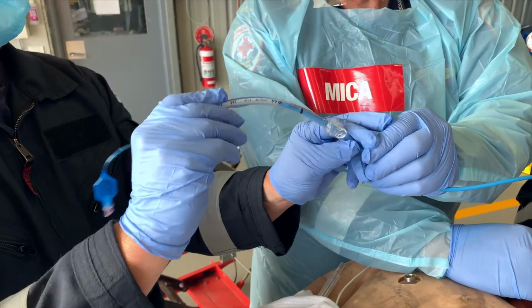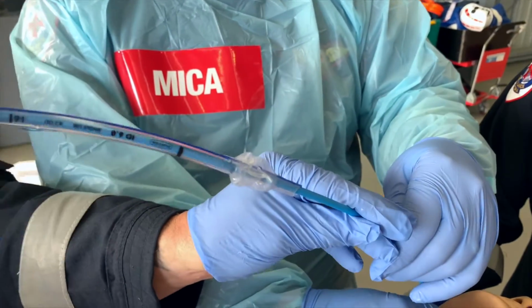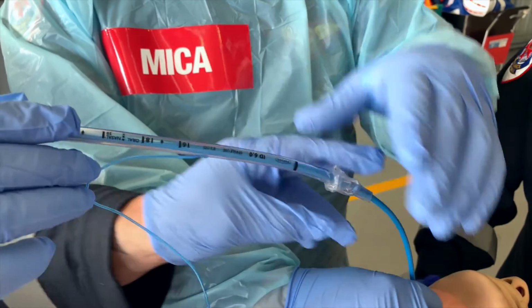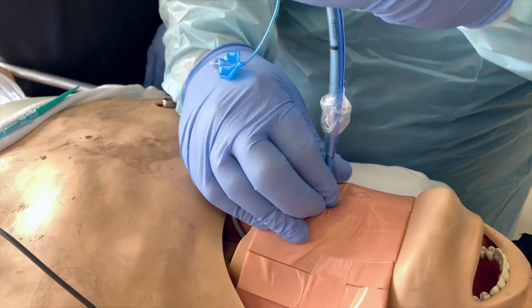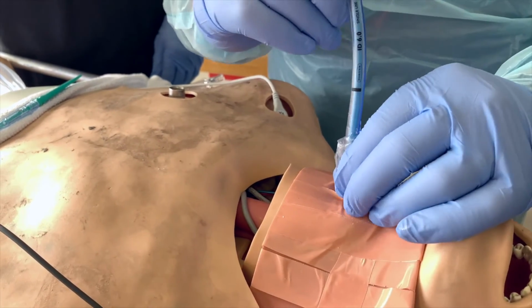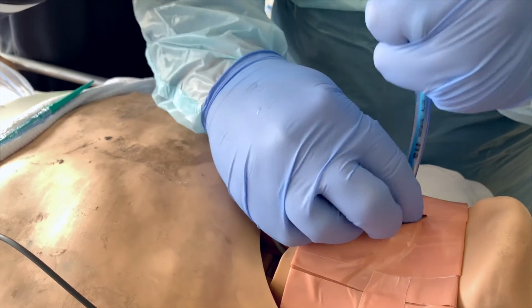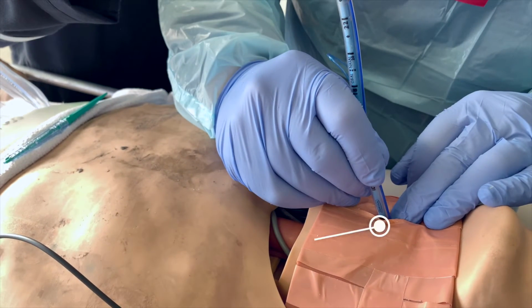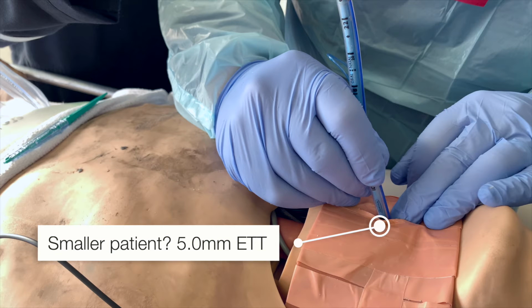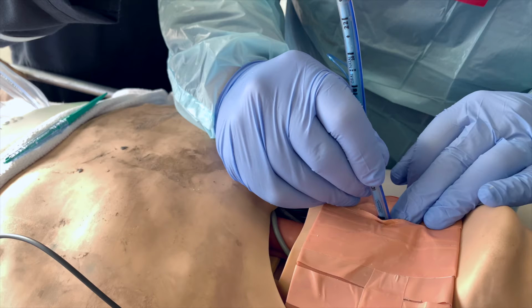ETT insertion follows the familiar practice of railroading a tube over the bougie. With assistance, the lead clinician pushes the lubricated size 6 ETT over the bougie through the dilated membrane. Rotation of the ETT during insertion may assist passage if resistance is felt. While the size 6 ETT is indicated in adults, a smaller ETT may be necessary for smaller adults or children between 12 and 16 years old.